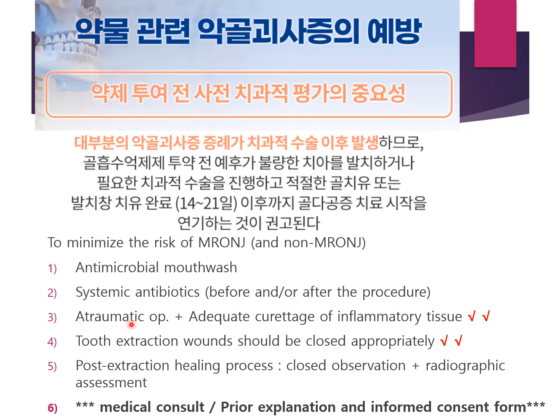Atraumatic operation should be performed, and at the same time, adequate removal of inflammatory tissue should also be performed. And tooth extraction wounds should be closed appropriately for advanced healing, not primary closure, just appropriate approximation.